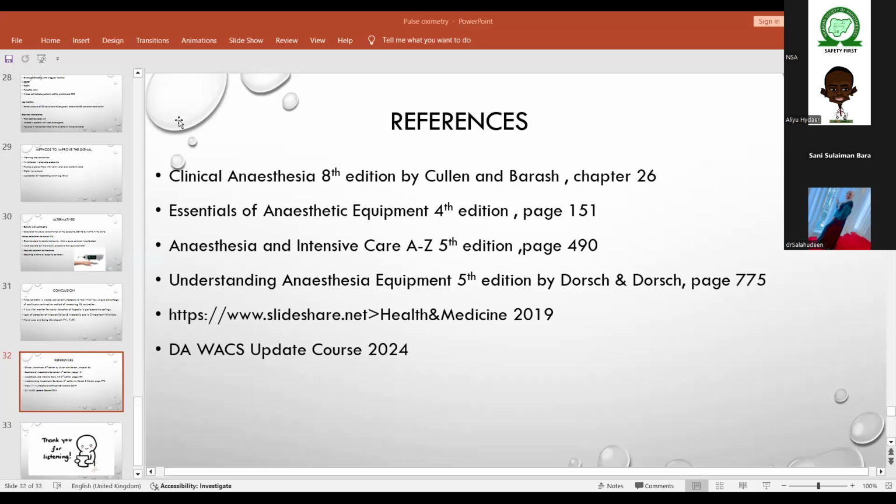Okay, well done. Another question from the chat box: thanks for the presentation. Is pulse oximetry efficient at a low SpO2 reading of 50%? No, from 75 it is not, because the saturation pressure is not optimal for it to give an adequate reading. It's not reliable from 75, before you even get to 50. Thank you.